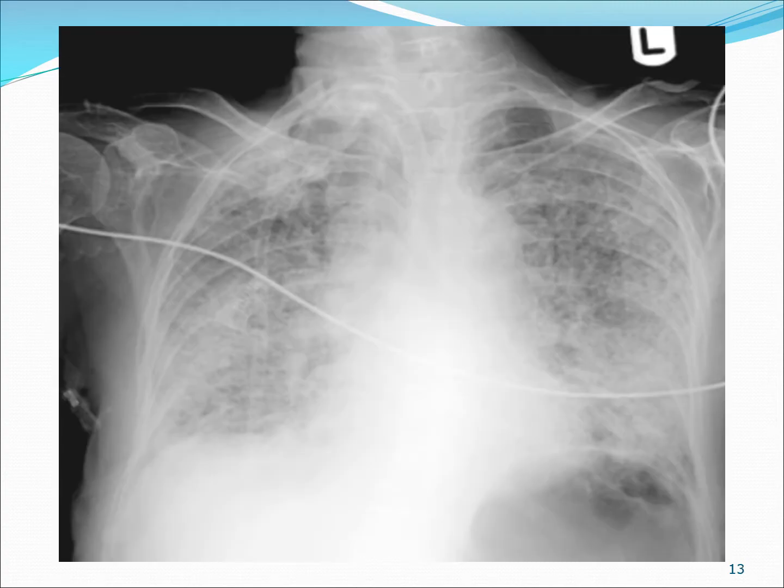This is a typical x-ray of an ARDS patient. Some of the things you want to look at is the ground glass opacification. Basically, you see this honeycombing area right here. And there's a lot of white out here, so you can imagine this lung is really not doing very well with oxygenation status. That is the typical findings with this, and you should be aware of this.